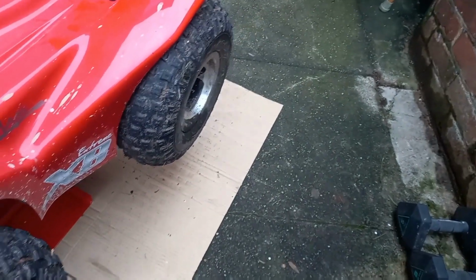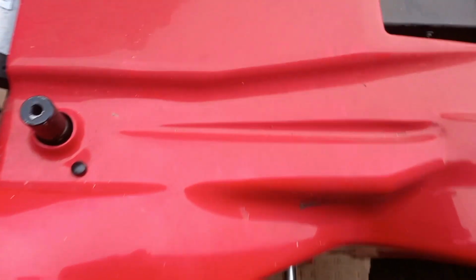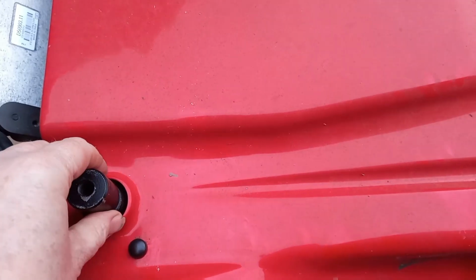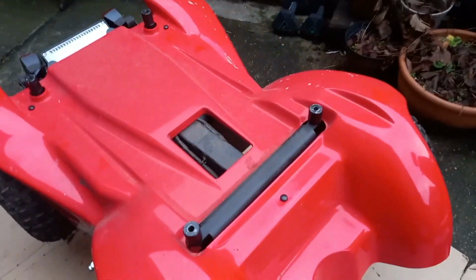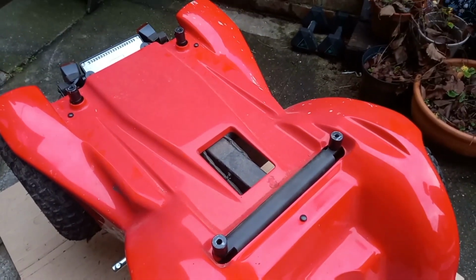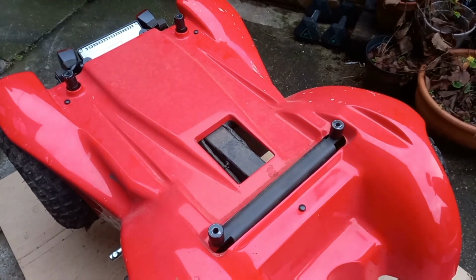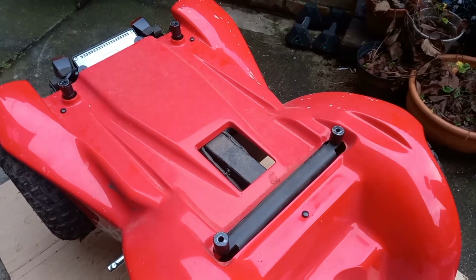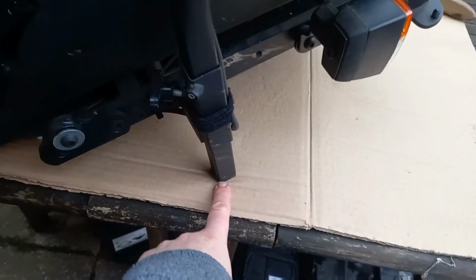To be honest, lifting the batteries out and the seat is the hardest bit, really, because the seat's quite heavy. Worst bit with the seat is these are all loose. The turrets on there, they're loose. They obviously fit different seats, you see. Lots of different types of seats. Ones that lift, ones that tilt. And there's obviously a whole array of mountings for the seat, so they have different turrets, and so that's why they don't weld it. You see, they've got loose turrets. But you've got to lift it on cleanly because these are sticking out.